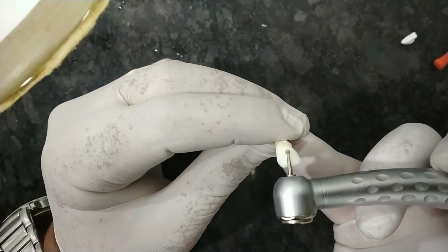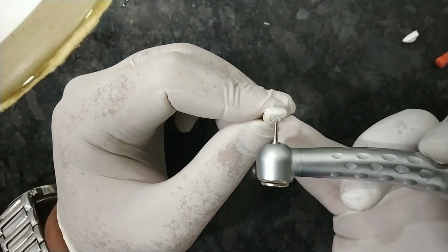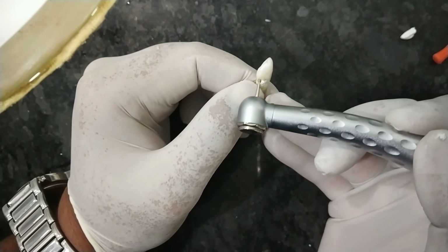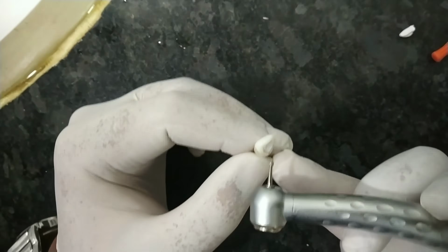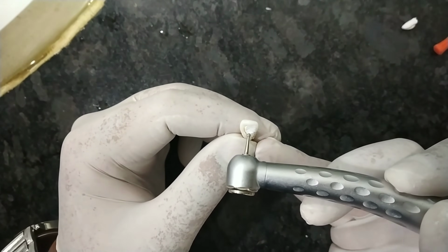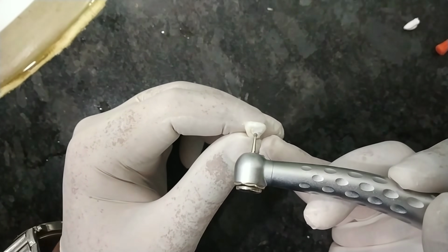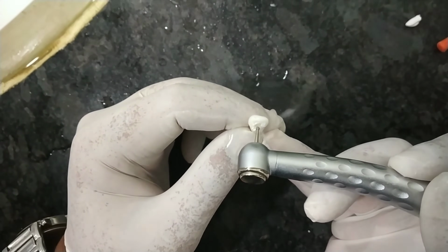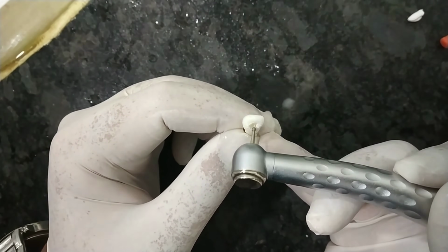The limitation of your burr should be till the CEJ of the tooth. So this is the cemento-enamel junction of the tooth, and here we first make the punch hole like this.